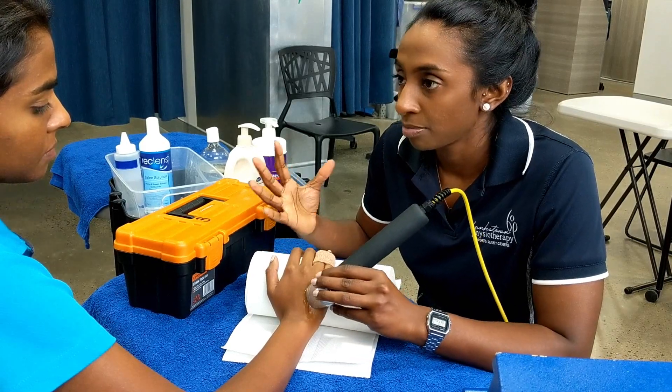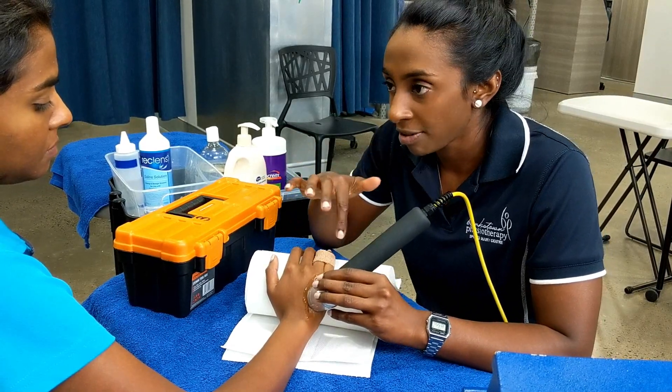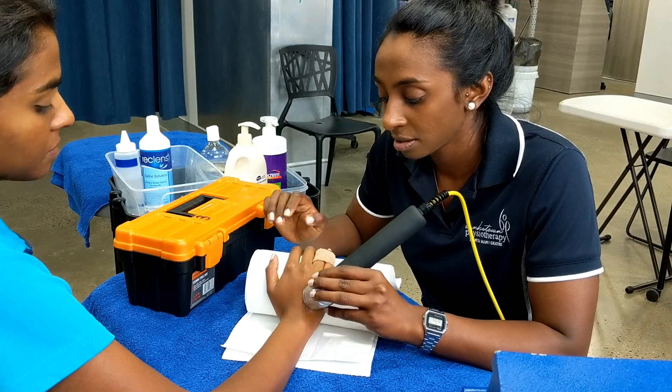Other ways we can do this is through massage or exercise, but because of the fracture we can't do any of them just yet, so in the meantime we use this.